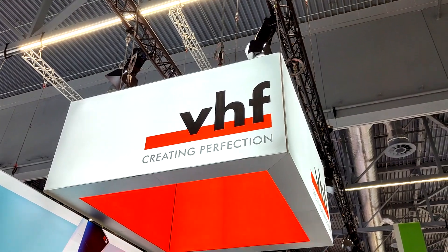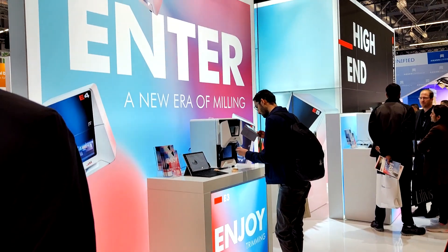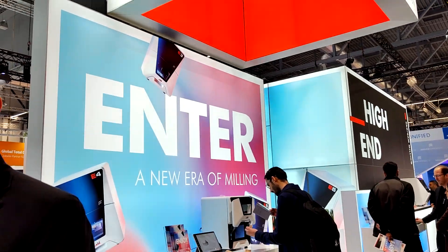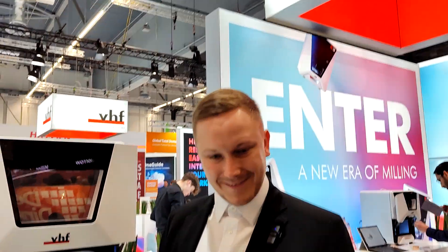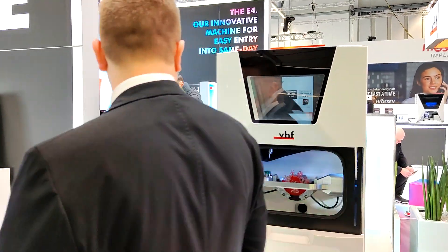Here we are on the VHF stand, where they have some pretty nice new products and new approaches for customers. Christian Raab from VHF Camfacture AG, a technical service specialist, introduces the E5 — their all-new product.